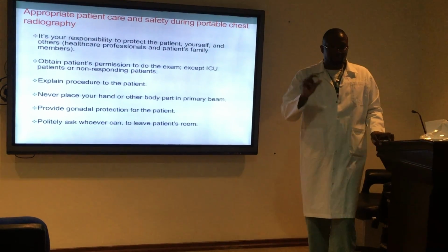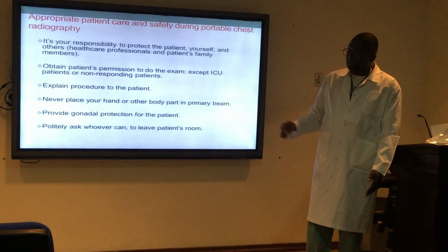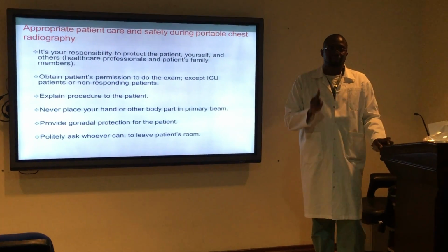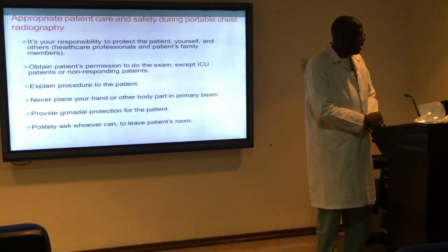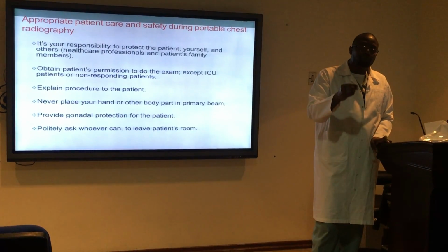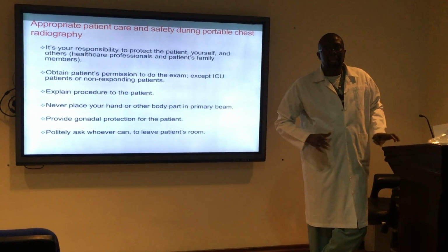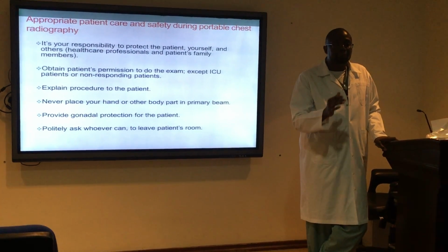And always remember, when you position the cassette and your patient, you put the cassette in the proper place. Never put your hand in the primary beam. This is for your own safety, okay? Whenever it's possible, always try to protect your patient with a lead apron in their gonadal area. This is very important.